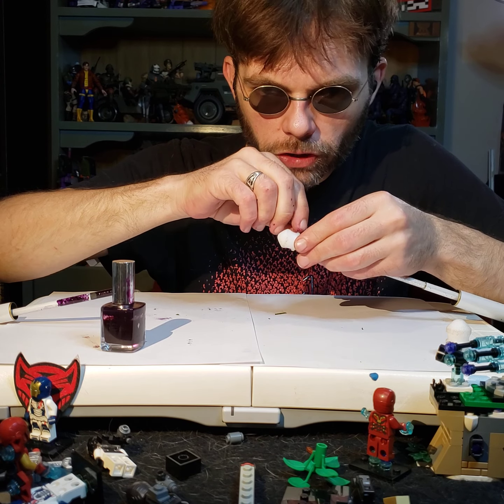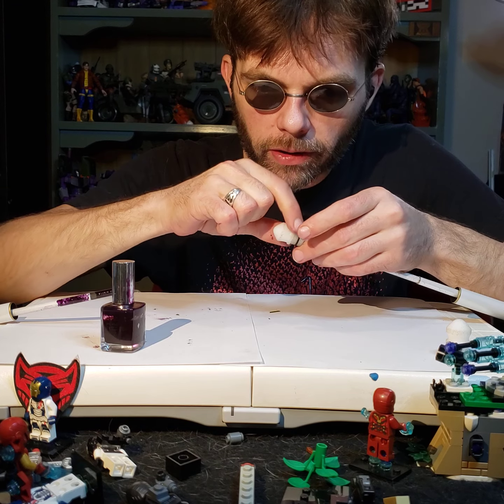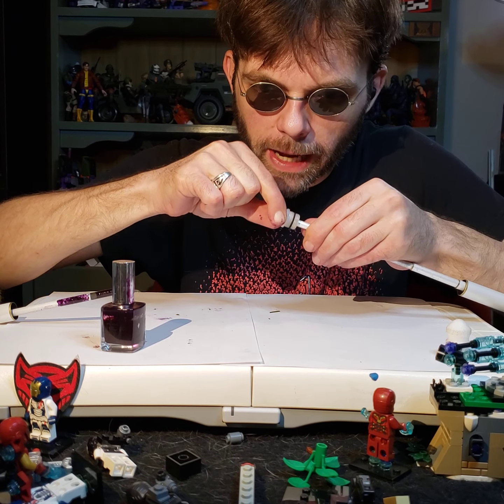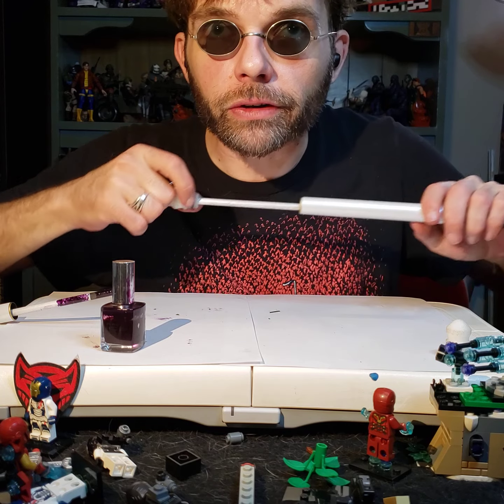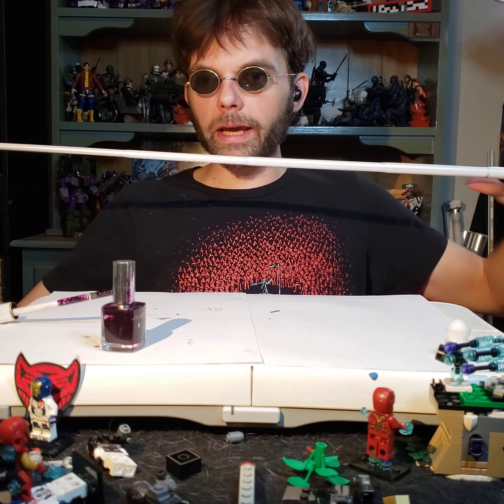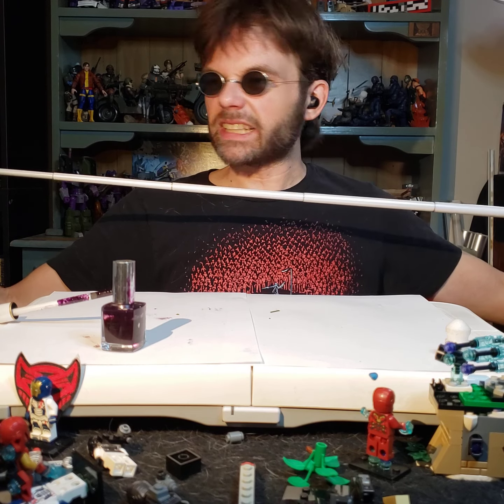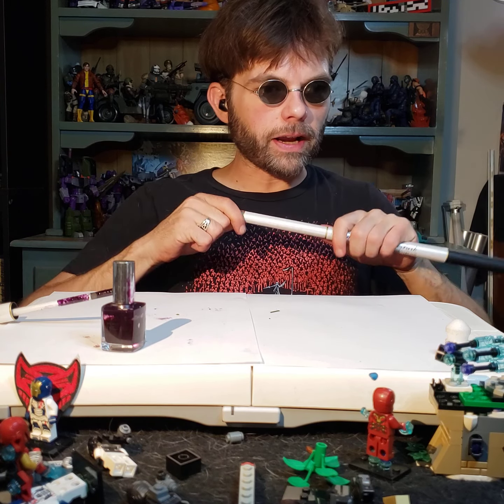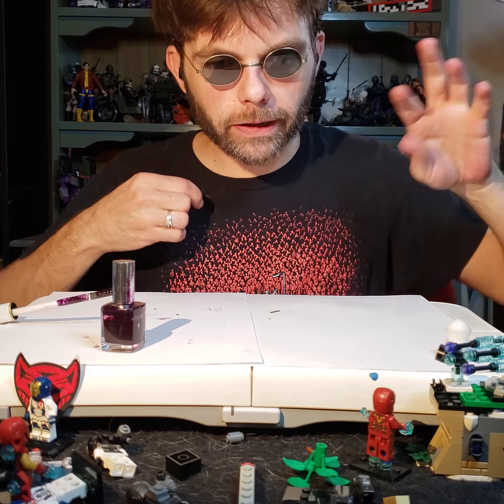You don't want it to go too deep. It will crack your carbon fiber. So you want to put it in there where it's stiff, it's not pulling out, but at the same time, you can unscrew it when you need to repair it in the future. Cane 1 is done. Let's just pull it out again and see. Oh, look at that beauty. I'm so happy with this. All right. Collapse it back into itself. 1 is done. Set it off to the side.